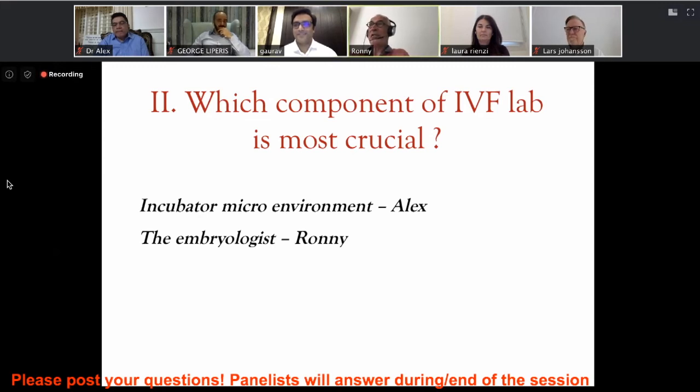So we should look whether they are well trained, doing the right things, and not making the same mistakes against temperature, osmolarity, pH, whatever, all these issues. And think of it that we did not even mention the operator or the embryologist in the previous list. What about you, George? In one word.